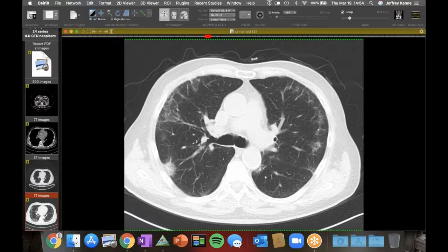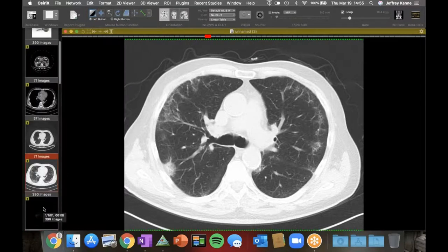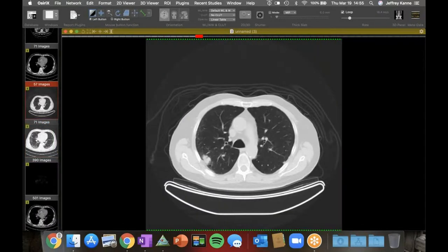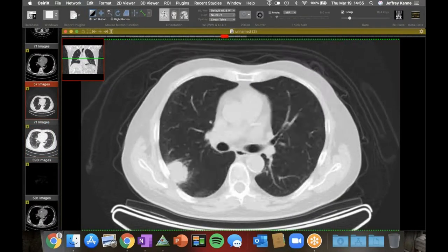And the question is, we've shown cases of, and I think most of us are aware of these adenocarcinomas or lung cancers that show up in the fibrotic patients. The ones we see are often more in the lower lobes and they're usually right along the edge of the fibrosis. This one was followed up on a PET CT and I'll just show, I think these are the attenuation correction images. You can see it became bigger and more solid.